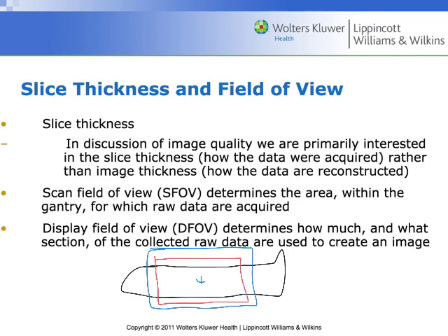So, for example, little old lady with a kyphotic back, you know, when I lay her down on the scan table, her head's going to be way up here and her body's going to be down here, right? Because she lays like that all the time. So if I'm scanning her head, I'm going to lower the scan table to where her head is in the middle of the isocenter for the gantry, right? If I'm scanning her thorax, I'm going to raise the table up to where her head is nearly hitting the gantry, and I'm going to center on her thorax, right? Those people can make life very interesting, but it's important for the scanner that the volume of interest is at the center of the scan field.